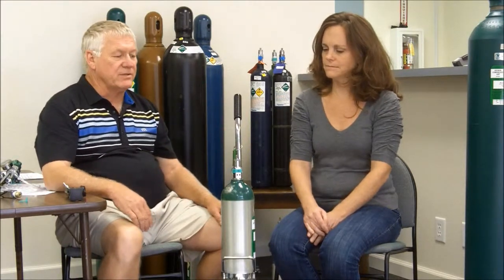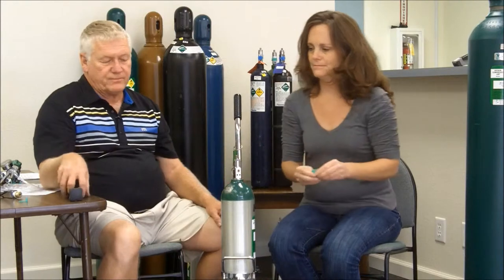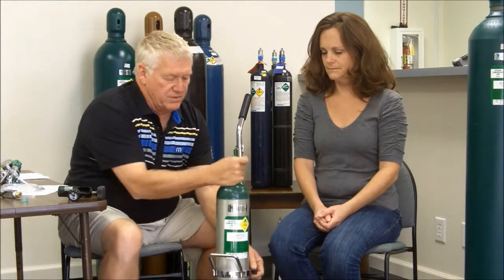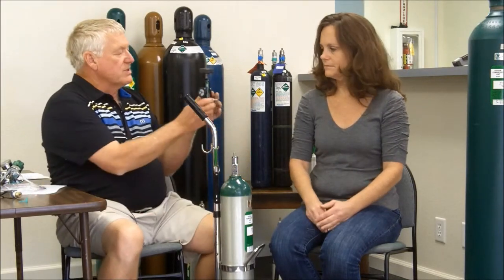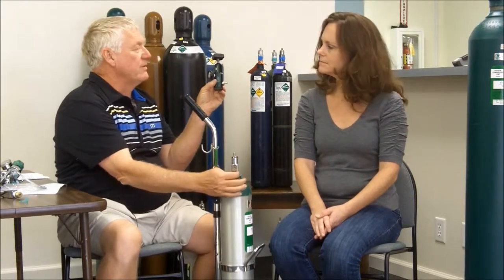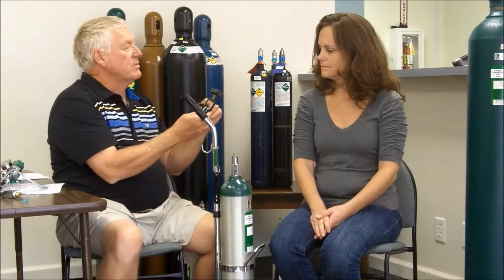I'm going to ask you to remove the dust cover on the cylinder. It's sometimes easier to rotate the cylinder so the valve is positioned with the oxygen orifice and the guide pins to one side. This is a regulator — if you can look inside the yoke you'll see two pins. Those two pins are going to align with those two openings.